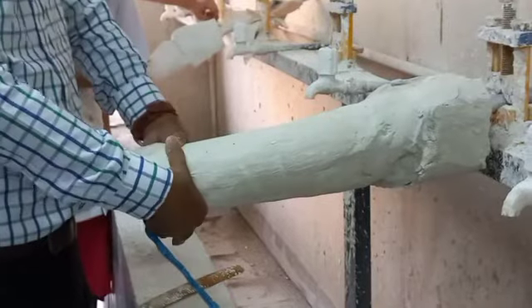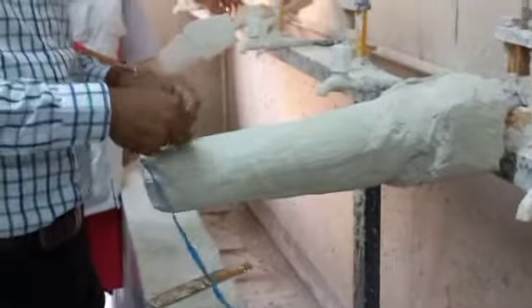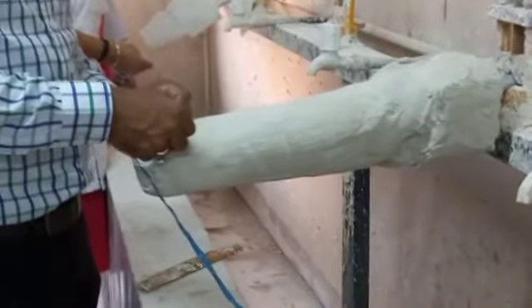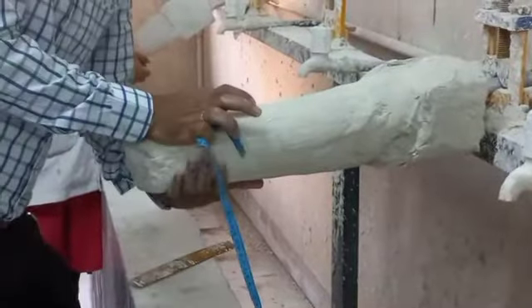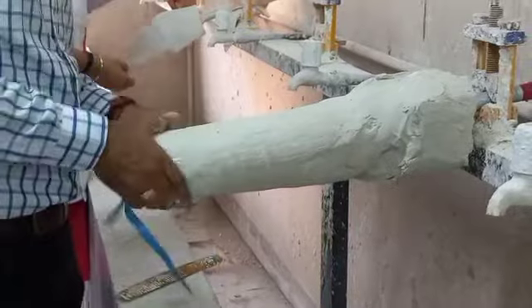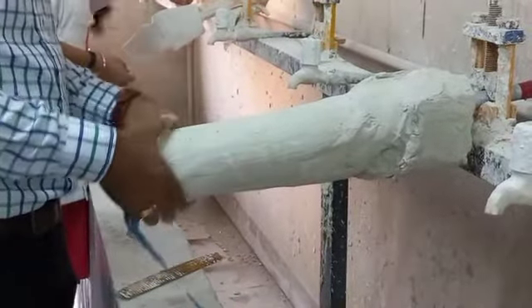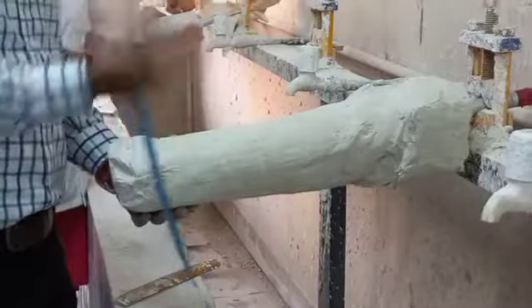If it is 35 centimeter over the patient, and at present if you measure, maybe it is equal to 35 only, or maybe it is lesser, just because you have compressed it very much, and therefore the volume on this side is reduced and the soft tissue has shifted upward, so the volume is lesser than the measurement you had on the patient body.